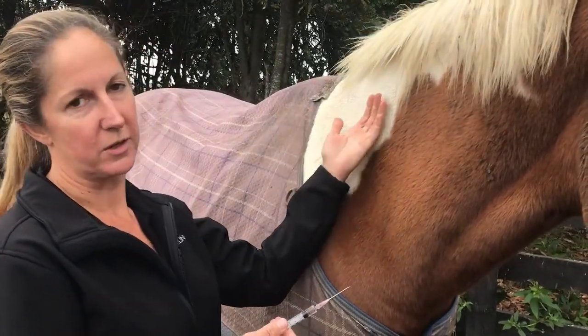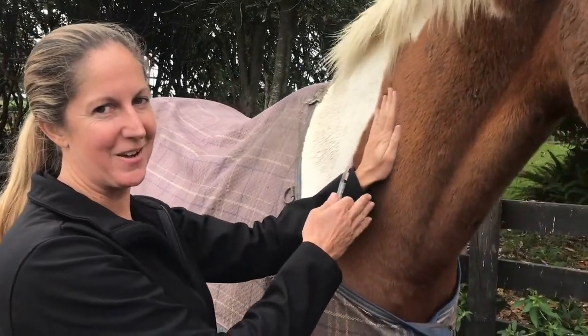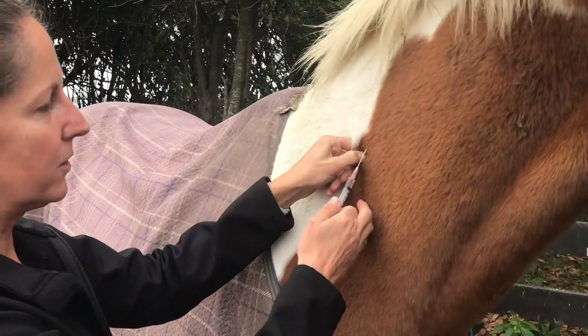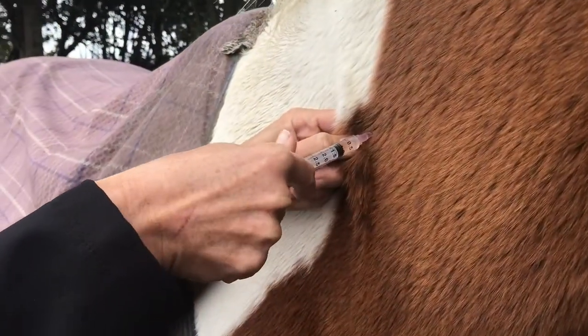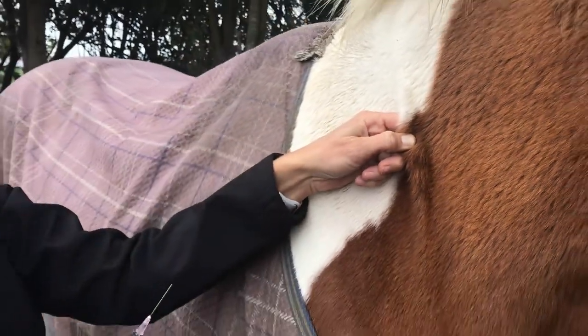She may be a little touchy now that we have to stick her a second time, but going through the landmarks again, we'll go in a new spot. Draw back — no blood this time. And inject. Very good.